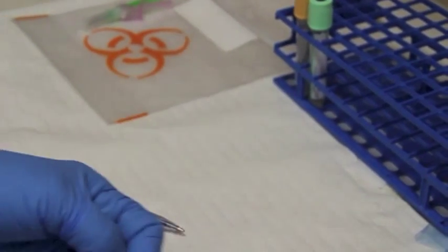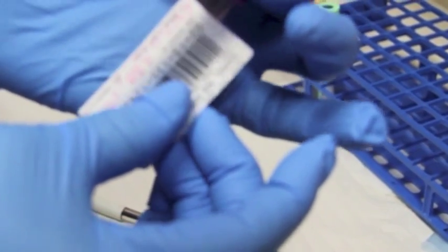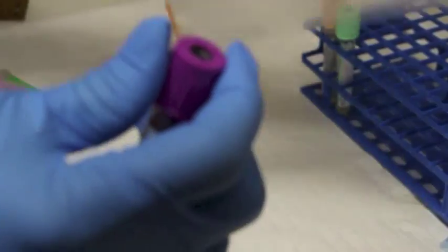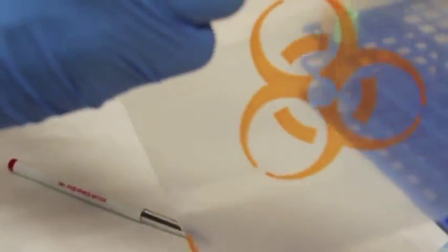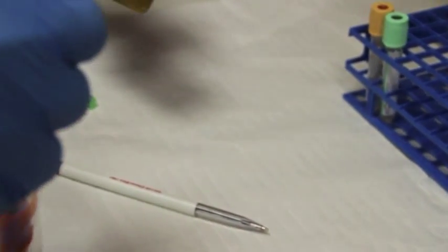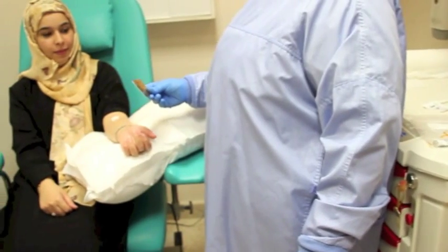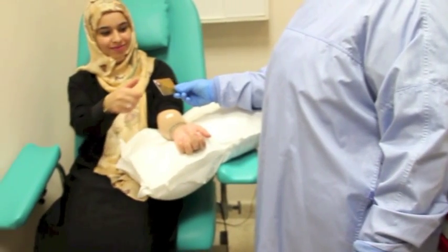The collector's identification number and the time of draw is written on the patient's label. This label is then placed on the tube of blood in the presence of the patient. The labeled blood is then placed into a plastic biohazardous bag and sealed. It is important that the blood is transported in a sealed bag to prevent any blood spills or contamination to the environment. The puncture site is examined prior to the patient leaving.